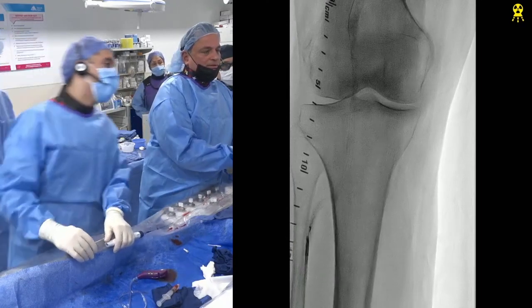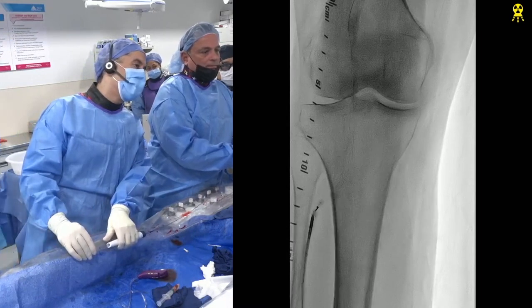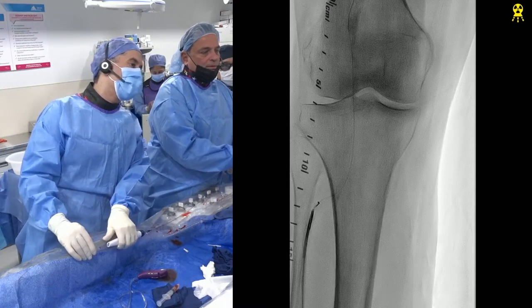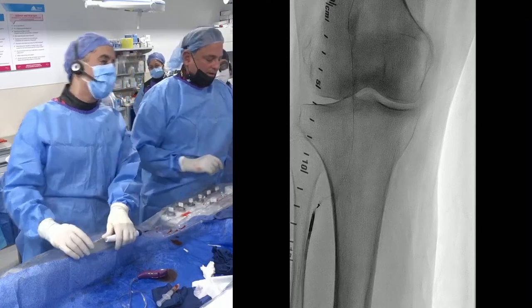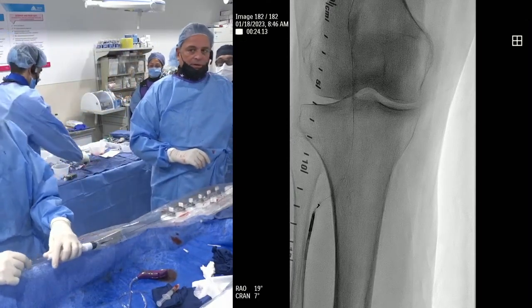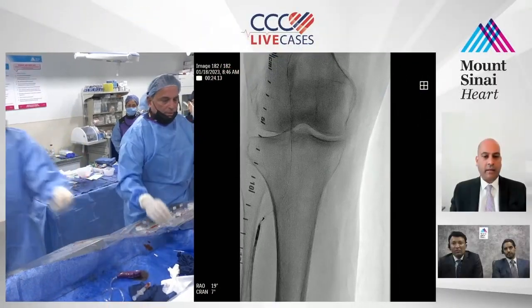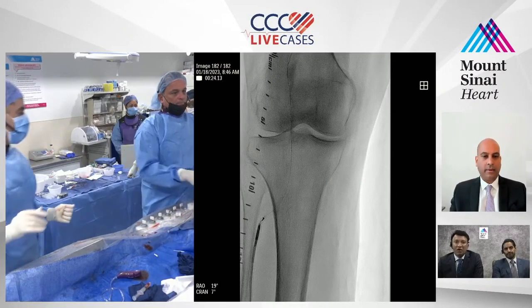It looks like there's a stenosis there. Yeah, you have to balloon your way up. It's all right, not walk it out. Get us a 3-0 balloon. 3-0 80 balloon. Proximal 80 though, right? Proximal 80 again at the proximal pop.